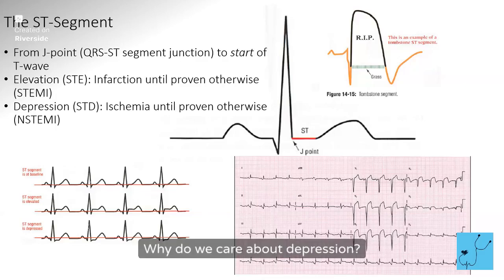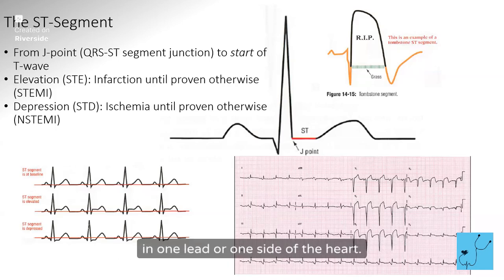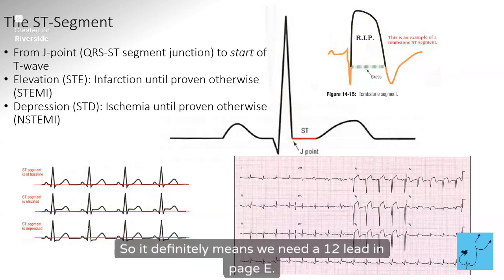Why do we care about depression? Because usually it's like a mirror. If you have elevation, and these are really bad elevations in one lead or one side of the heart, this is the front of the heart on a 12 lead, we have ST depression in the opposite leads a lot of the time. So if you see ST depression, it means they could have ST elevation in another lead. So it definitely means we need a 12 lead EKG.